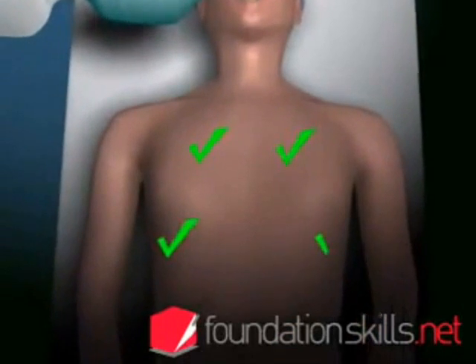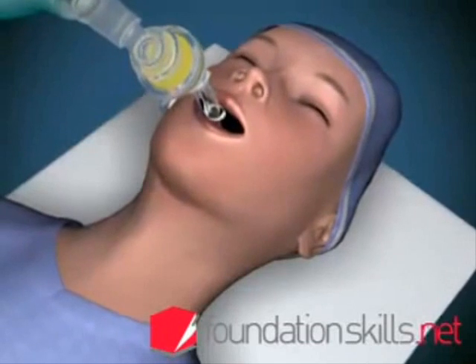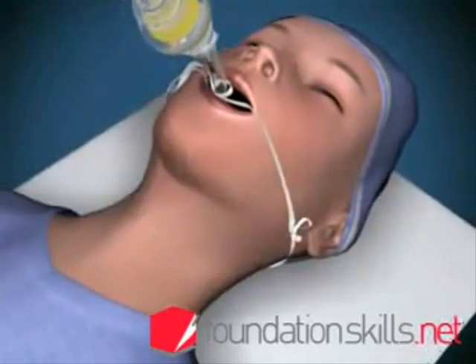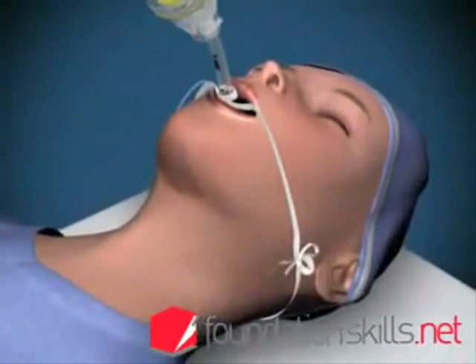Re-inflate the cuff and re-check the position. When the tube is in the correct position, tie it in place with cotton tape and attach the tube to the ventilating apparatus and ventilate the patient.